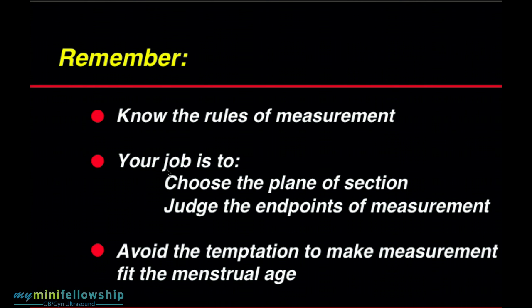Your job is to choose the plane of section and judge the endpoints of measurement. If you have the correct plane of section, then simple observation of the endpoints will tell you not only the degree of error, but the direction of the error. Remember, this is all you need to make a rational judgment as to whether the fetus is normal or abnormal, and as to whether or not the measurement needs to be repeated. I cannot overstress: avoid the temptation to make the measurement fit the menstrual age. It is a great temptation, but one that must be avoided at all costs.